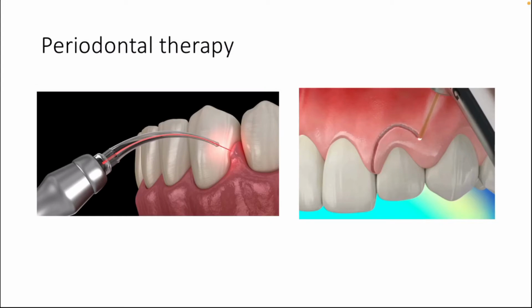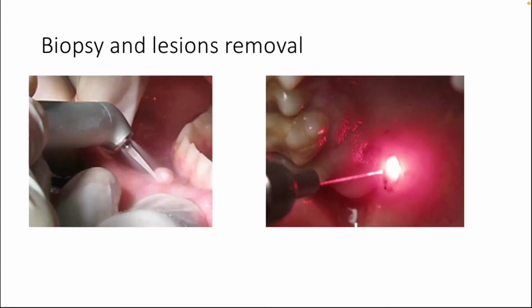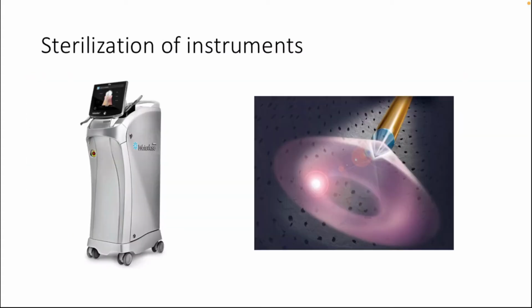In periodontal therapy, lasers have been used for performing surgical procedures to excise redundant and inflamed gingival tissues. For biopsy and lesion removal, lasers have been used to obtain excisional or incisional biopsy for microscopic examination. And finally, lasers have been used for sterilization of instruments very effectively, actually.